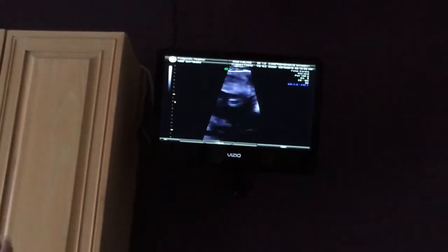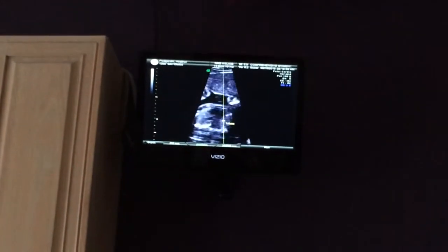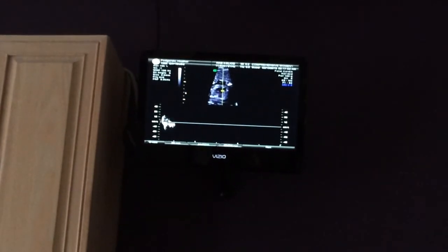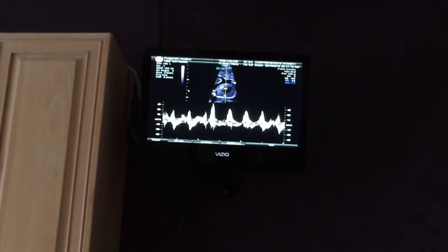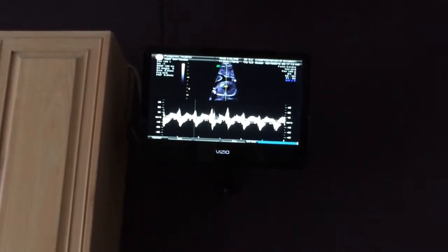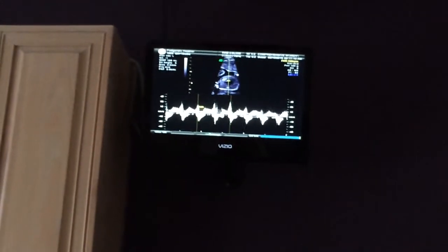In this picture you can see the heart rate there — let's see if I can get the heart rate while we're waiting. It's 155, that's normal.